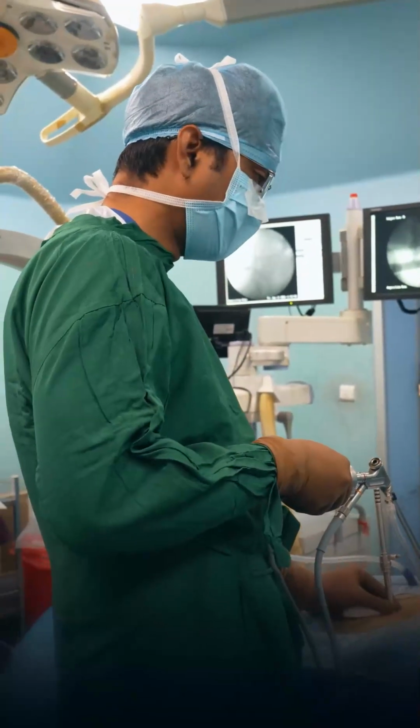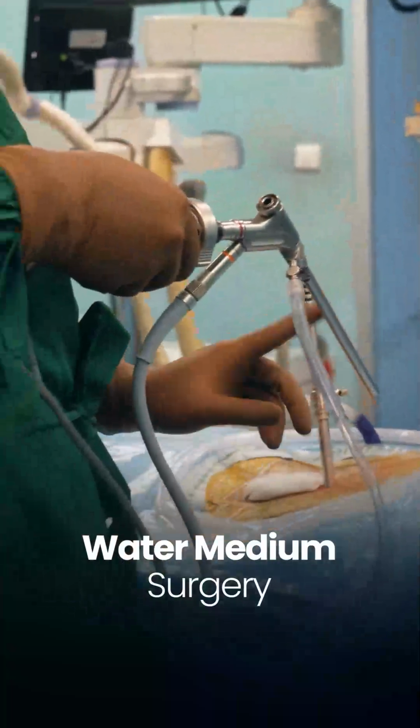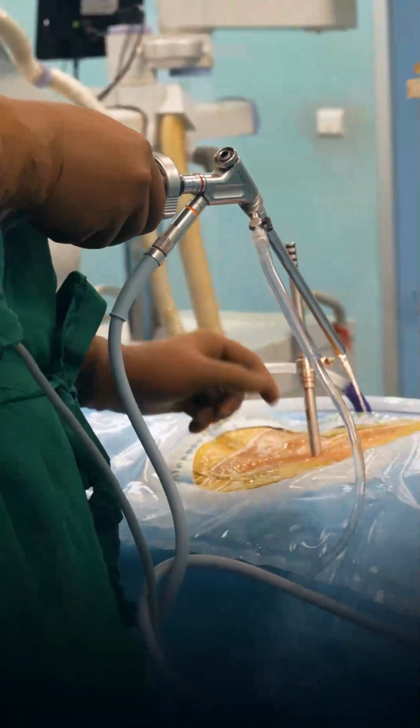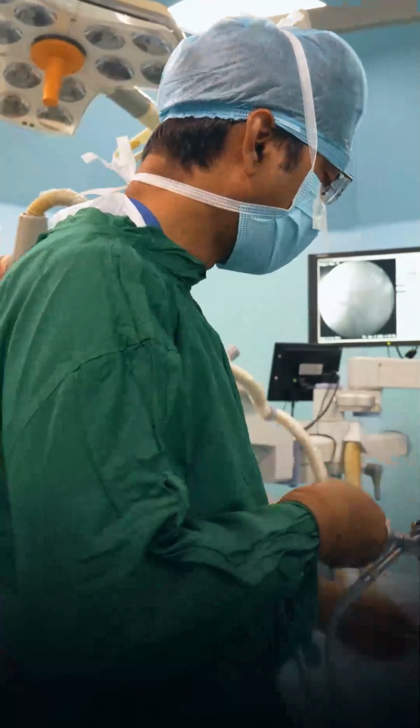And this is a water medium surgery. So you can see, yeah, water is coming out, which will create a good view. So we don't need to suck again and again.